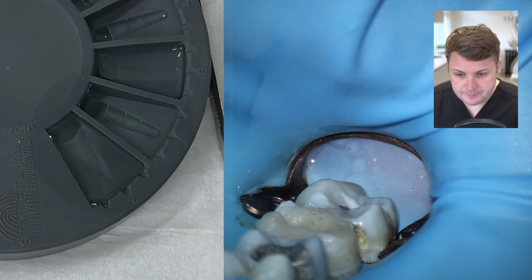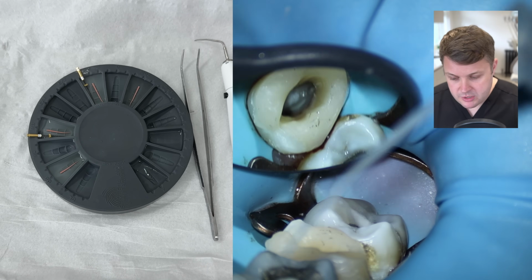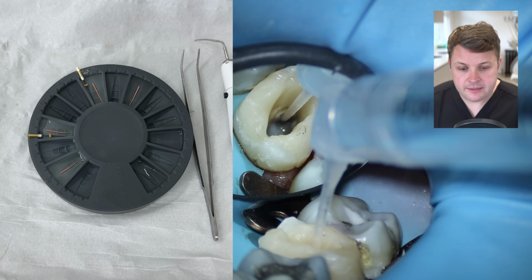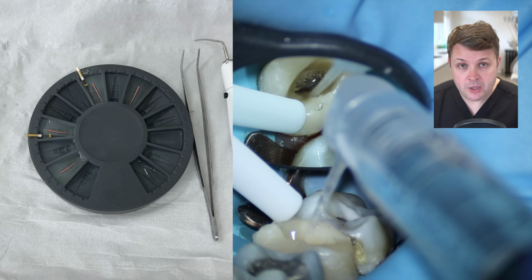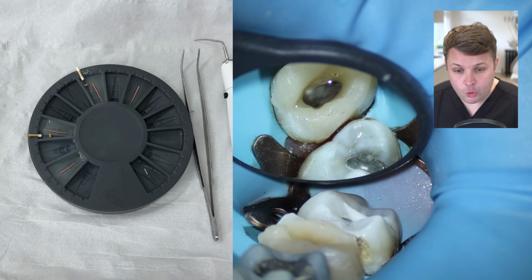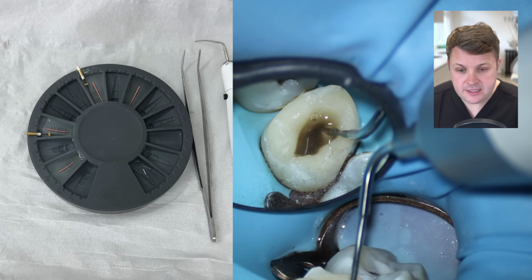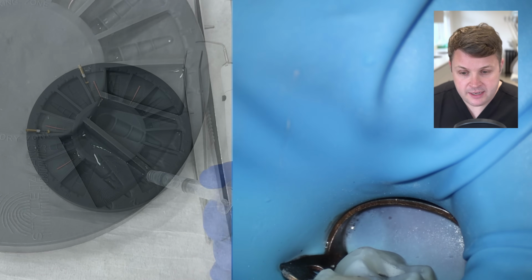The 17% EDTA removes the smear layer. When you're using our rotary files, it's creating a smear layer within the inside of the canal orifice, so that's going to be blocking all the tubules. Of course, the 17% EDTA also needs to be activated, so we're going to do that in a couple of cycles until the EDTA is clear.